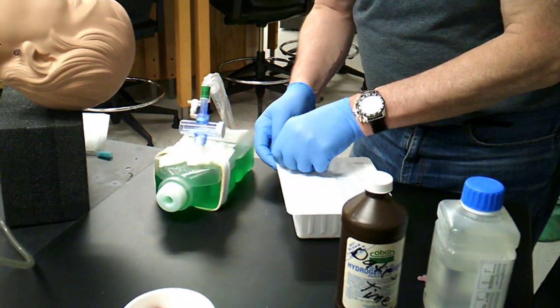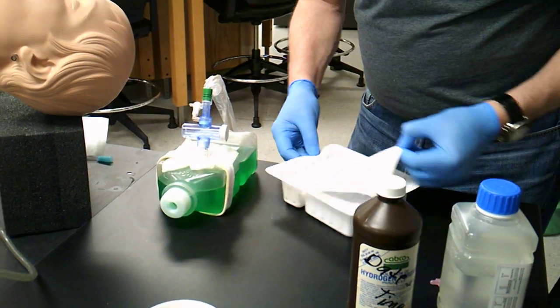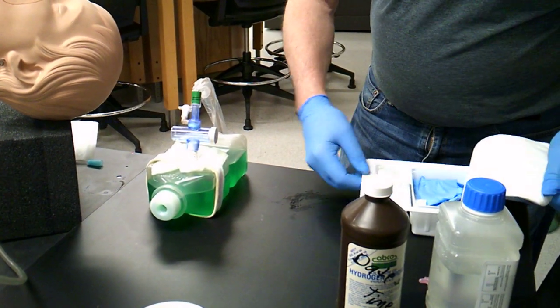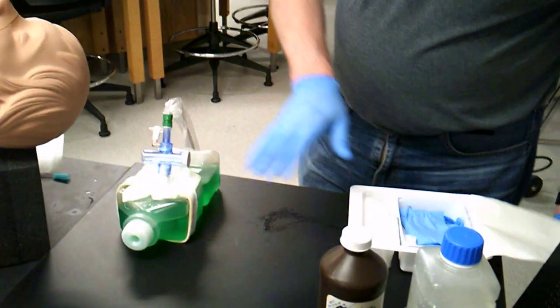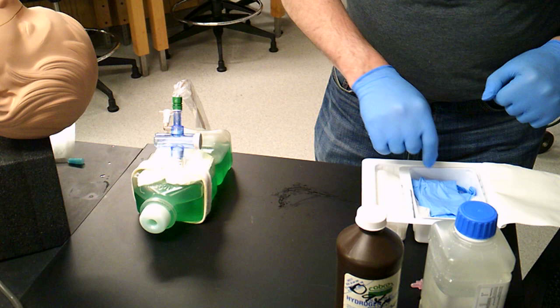This is, although it's technically a clean procedure, we're going to treat it as a sterile procedure. We want to maintain as much as possible that this trach dressing is maintained.